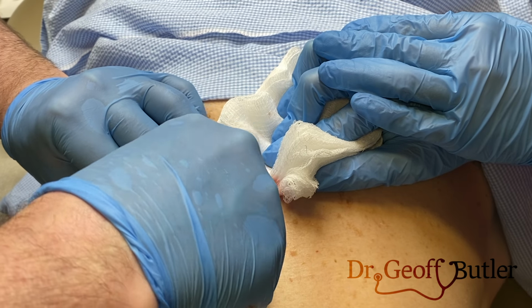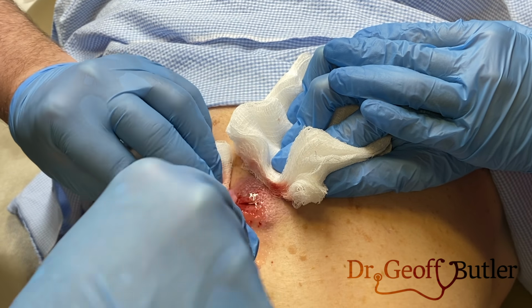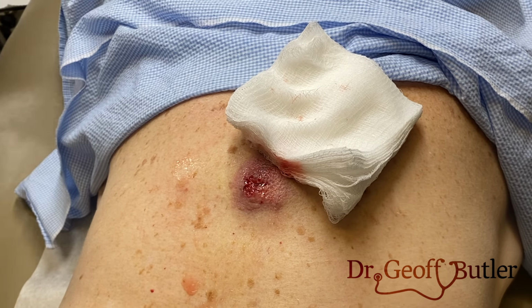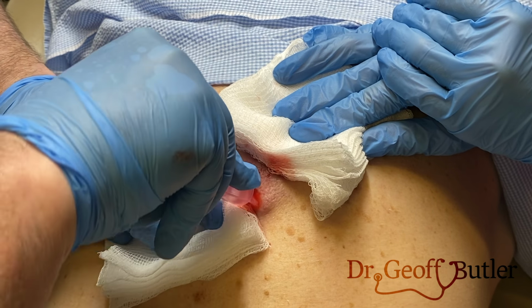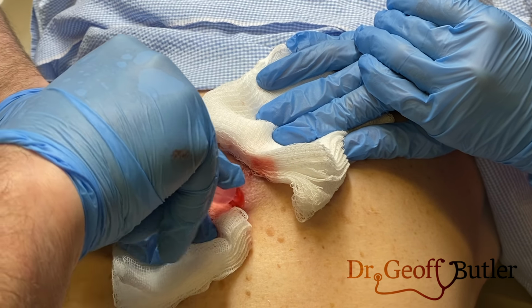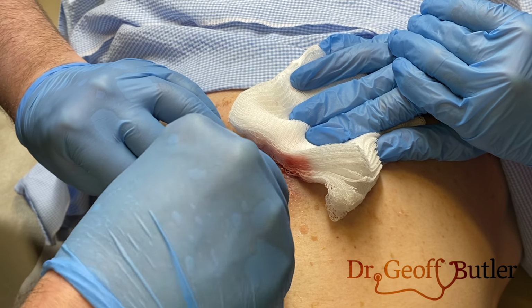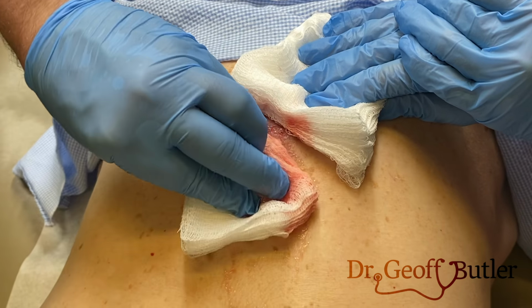So we want to clean this out as much as possible. Very good. That's perfect. So you just want to be shifting this around because you're trying to irritate the walls of the capsule and get some more debris to break off as much as we can. Very good.